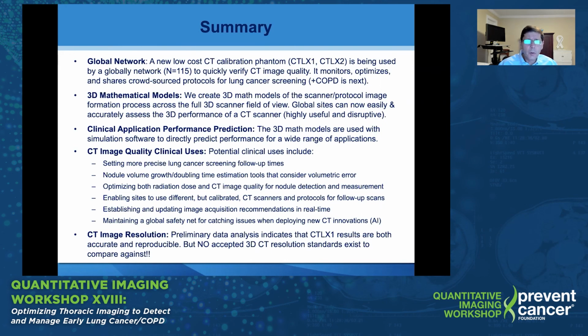Finally, it's really important that we recognize that there are no accepted methods for measuring CT resolution. And thus, even though we have a study right now that is indicating our CTLX-1 data is both accurate and reproducible, we are having difficulty proving it because there is no gold standard.